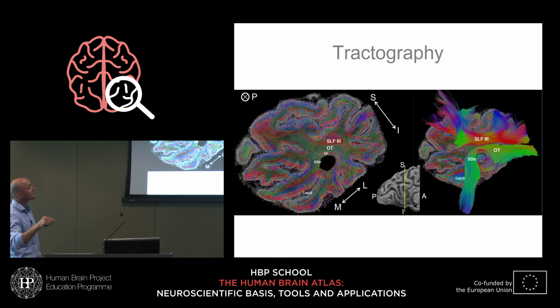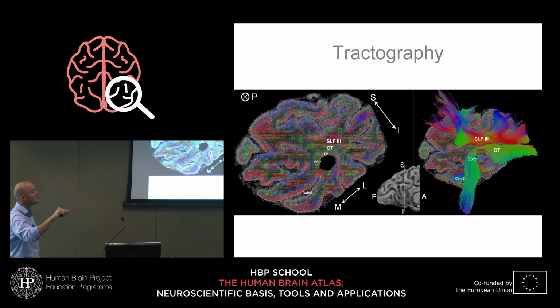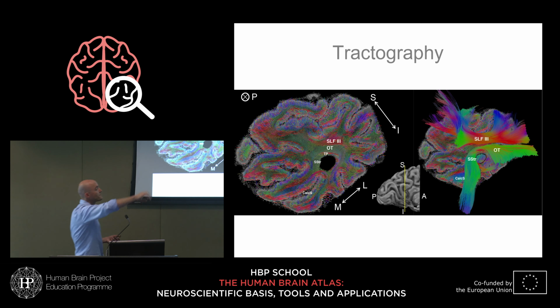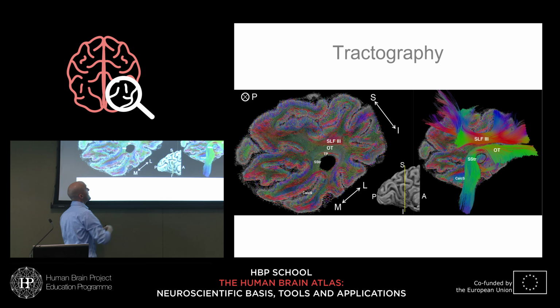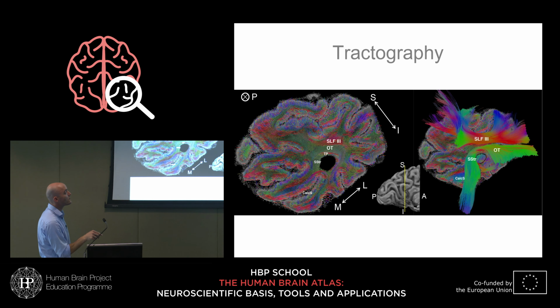Well, this already kind of gives you that answer. Here we're looking at a coronal slice through one occipital lobe. Here is the lateral ventricle. And here is V1, or the calcarine sulcus. So the optic tract will be coming from the thalamus somewhere over here, where my hand is now, and it will travel inwards, and it will curve around the lateral ventricle in order to get into V1. And so we could delineate all of that.